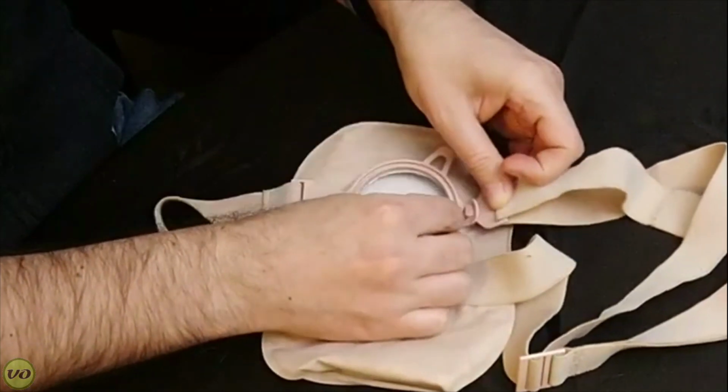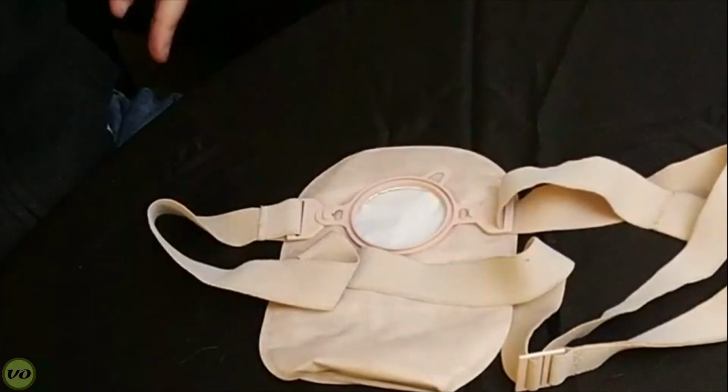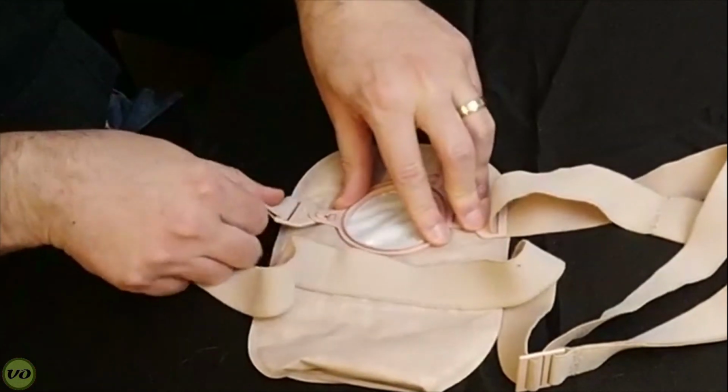And you'll usually do this when the bag is already on you, but you can see here how it's nice and secure. And that adds a bit of pressure, again, keeping that bag closer to your skin. If it gets heavy, it's not going to be weighing down and pulling on your wafer or anything like that.